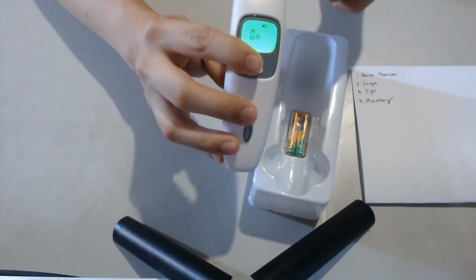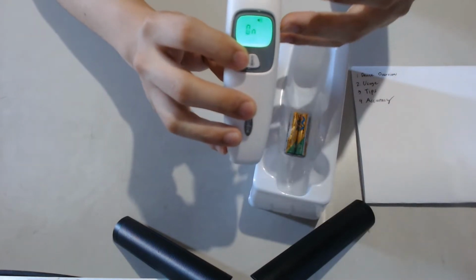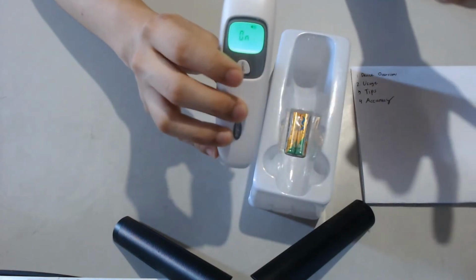A while ago, if you noticed, when I took the temperature of my ear, it would beep to say, okay, I took the measurement. I can turn it off.